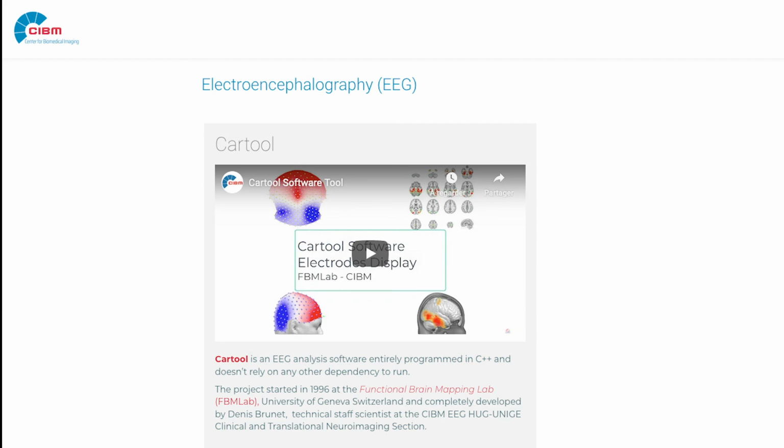Or is it really different? It would still be interesting to compute the 3 variants: the gray mask of Cartool, which I call a mask because it's quite thick, the one that you're talking about, and the third one would be the whole brain, except the CSF of course, to see what's happening. Yeah, that would be interesting.